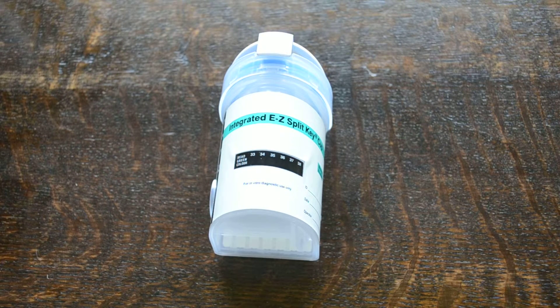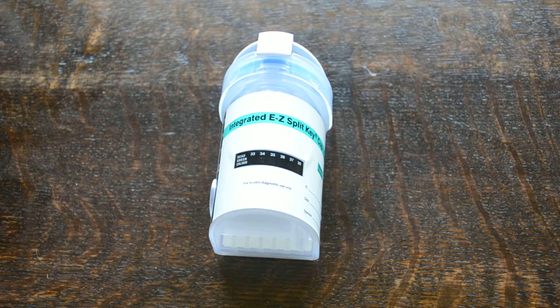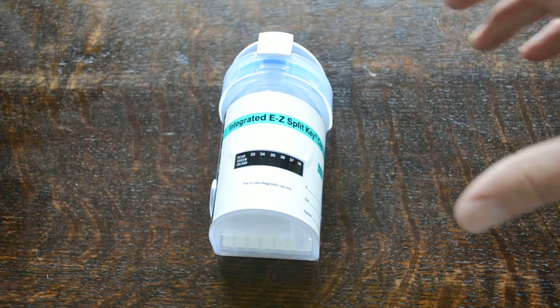Welcome to this video where we're going to demonstrate the integrated EZ Split Key cup design of drug testing cup. The EZ Split Key, which is a registered trademark product, has a unique design when it comes to cup tests.